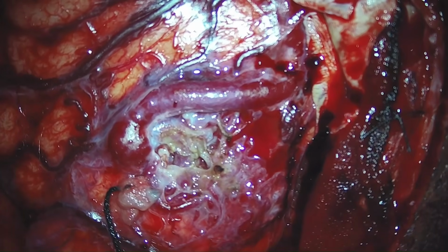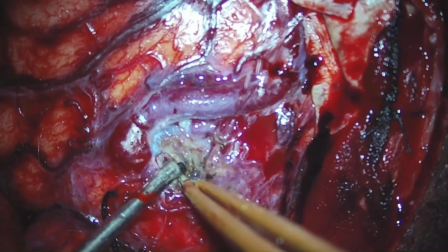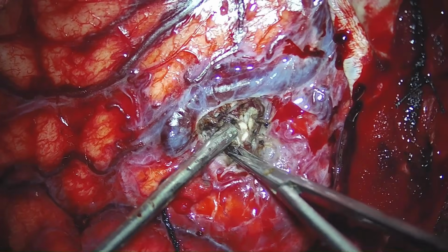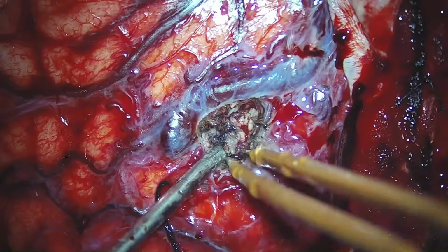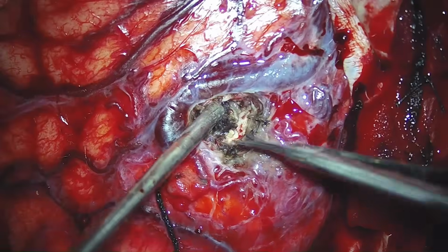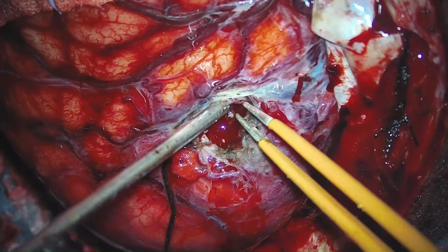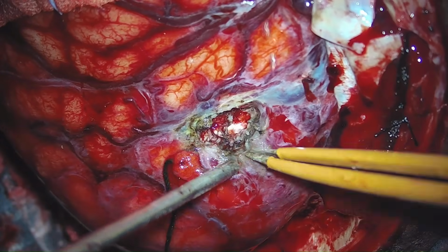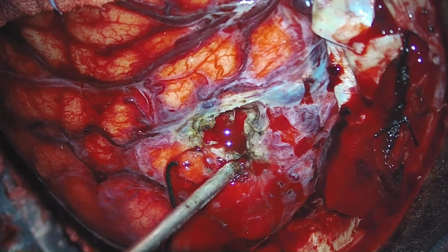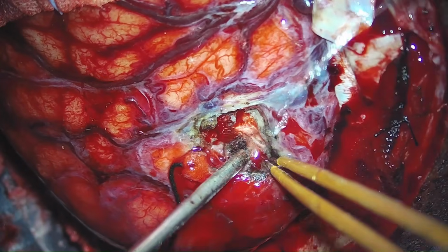The AVM is sitting directly over the motor area, dominant motor area. The procedure has to be done very carefully without damaging any normal brain. Once this is done, the AVM complex is completely coagulated and removed from the normal brain, and the draining vein is also coagulated. Once the hemostasis is achieved, our surgery has been completed, and we close the brain in layers without the bone flap.